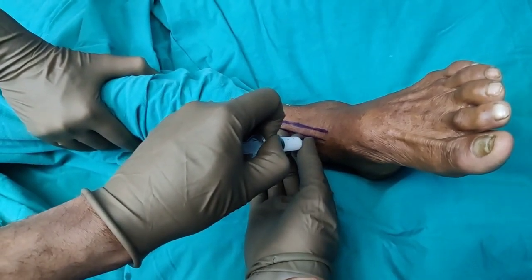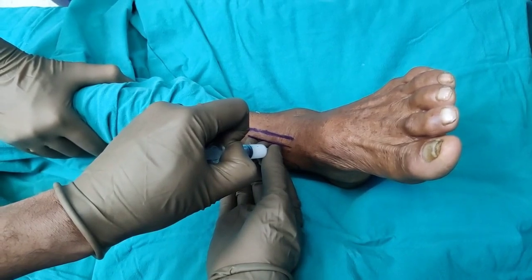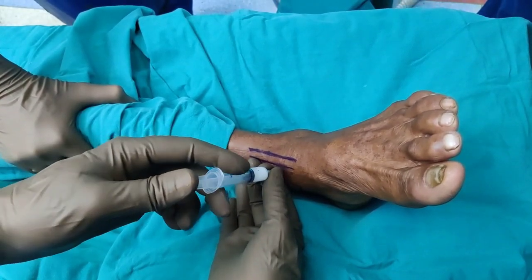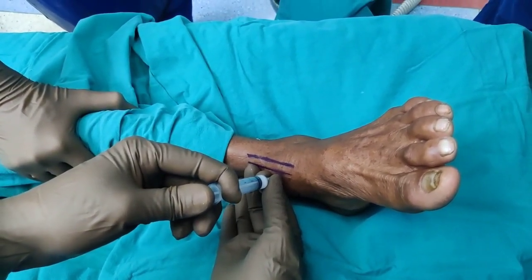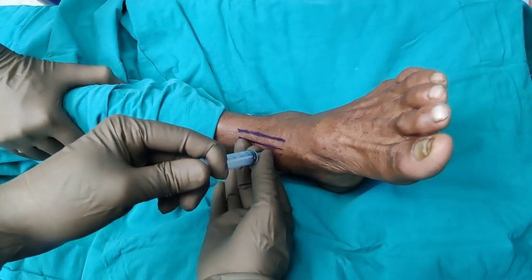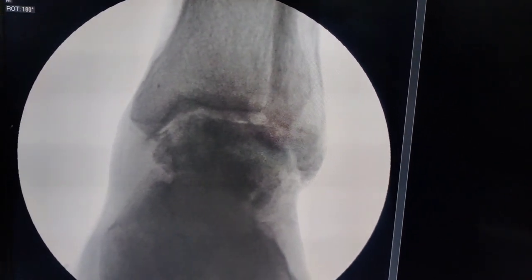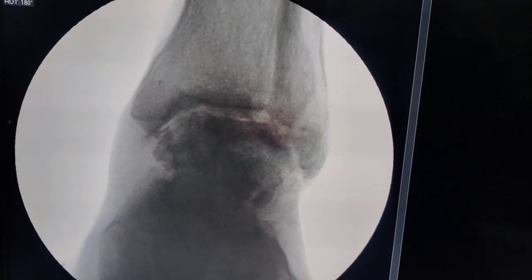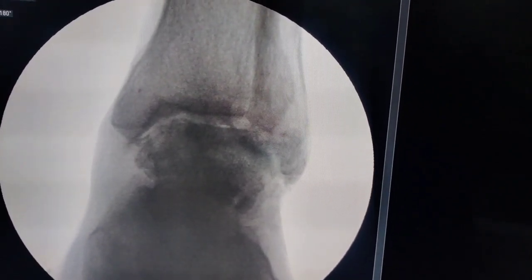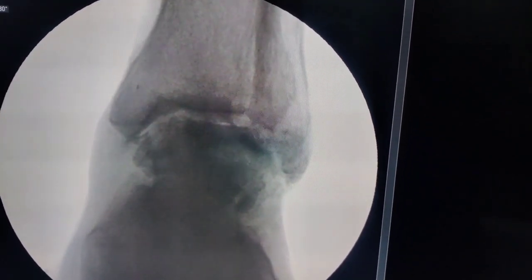Just gradually inject the steroid — it will be slightly tight. It would not be like injecting into a subacromial space because this is quite tight. You need to apply some force and the steroid will go in. When we re-X-ray, you will find that the dye has been flushed out. If you notice in more detail, you can see the ankle joint is also slightly opened up — that is because it is a closed space and you have injected 3 ml, so the joint is distracted. You do the same thing when making a portal for arthroscopy.